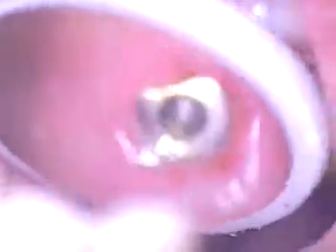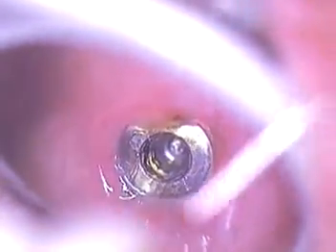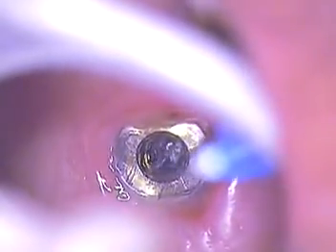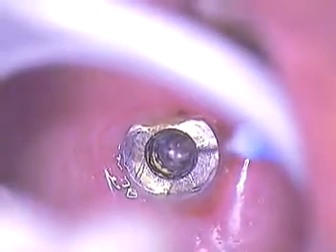We'll move now to the molar region, and I'm going to go ahead and do the same. Now, with the molar, you're going to see that there's more involvement. It also turns nicely in a counter-rotation.